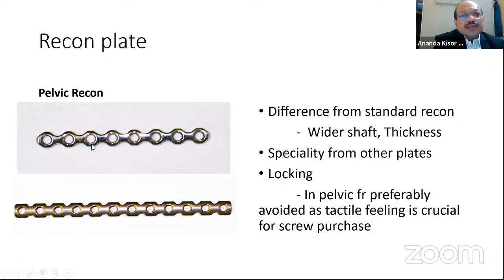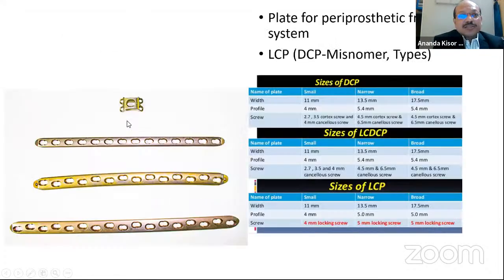If you use the locking recon plate for a pelvic fracture, this tactile feeling is usually missed. So in that case, locking should not be used. Locking recon should not be used for pelvic fracture. This is a catch, usually asked in the examination.